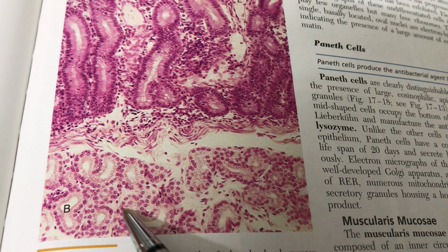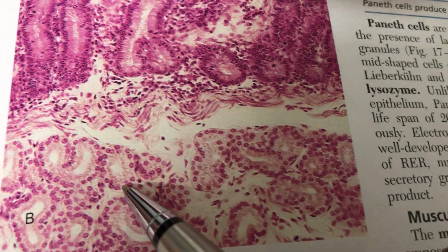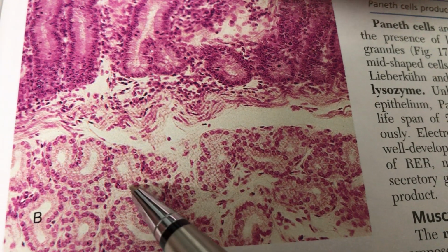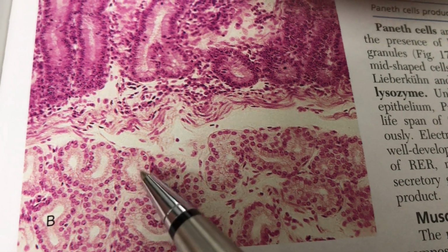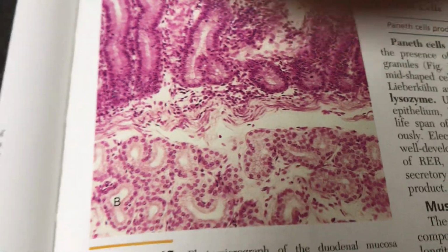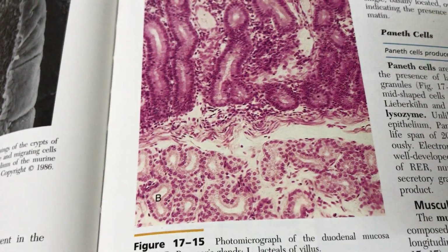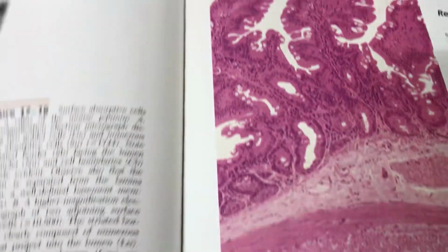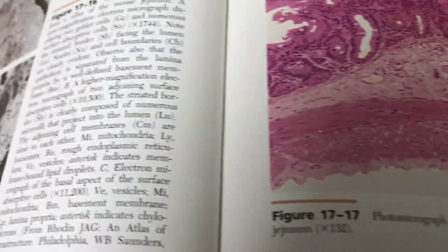And if you see down, you could see a lot of Brunner's glands. Brunner's glands, what is Brunner's gland? These are all alkaline glands and mucus-secreting glands, and this is a type of tubuloacinar glands. They secrete bicarbonate-rich fluid. So this is tubuloalveolar glands or acinar glands.